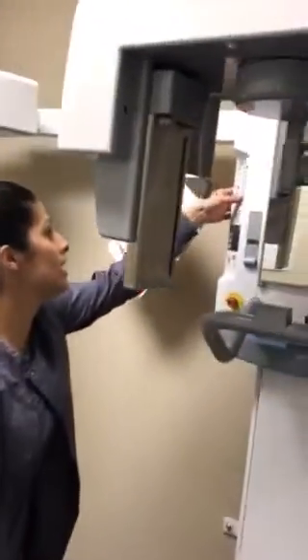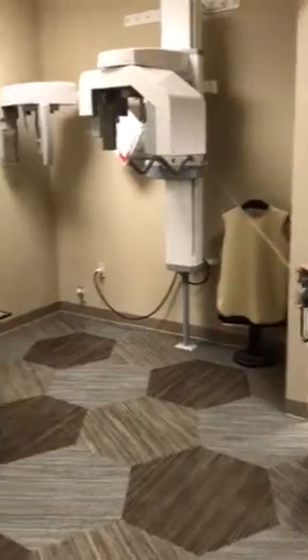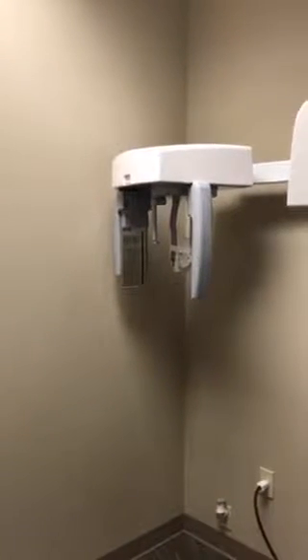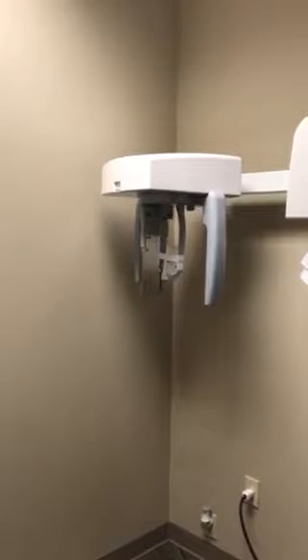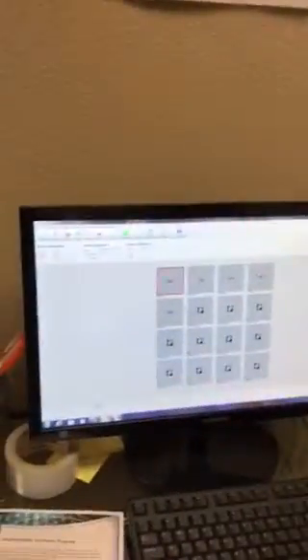So I am gonna go ahead and take a test. I have it on 63, which is what we normally use for the kiddos. Yeah, they're not there. And that is what you should get.